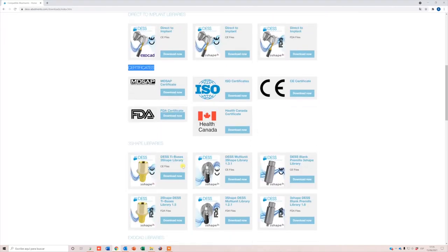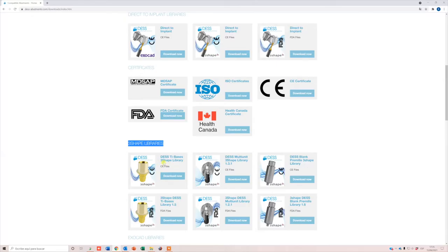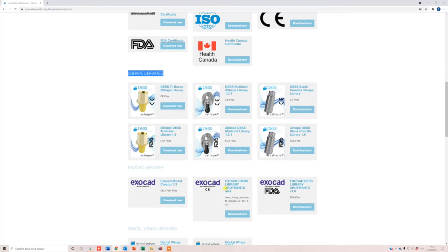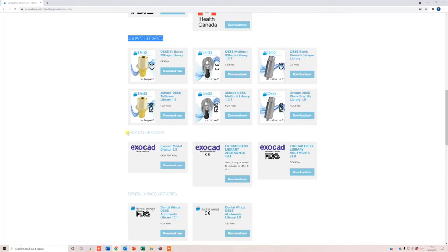Certificates: Libraries for 3Shape, Dental Wings, and Exocad. Both FDA and CE files are available. Please choose as per your needs.